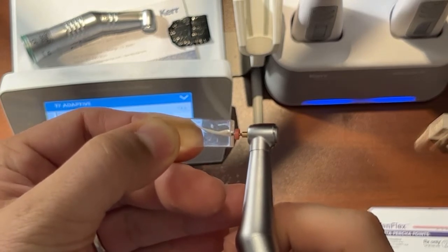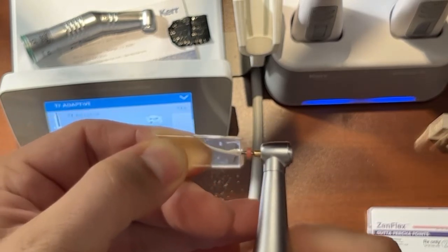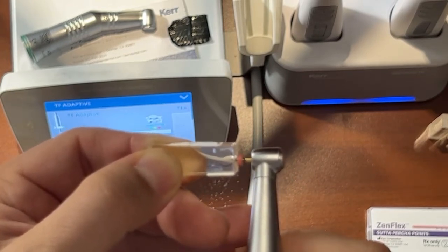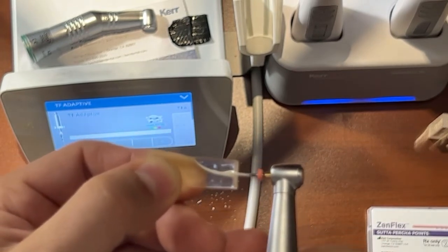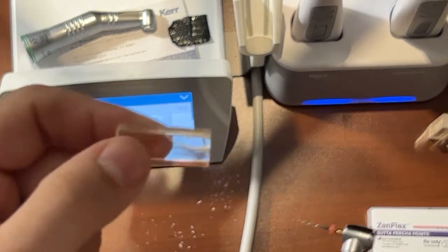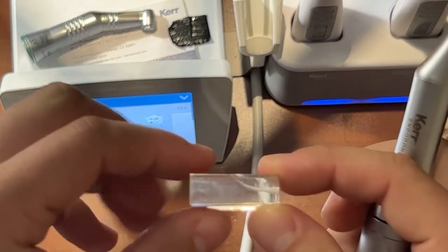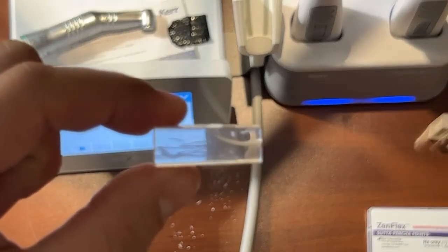And we're just shaping that file until we get all the way to our working length, which we just did. So now you are done. So you've done those 3 files and you have shaped that canal beautifully.